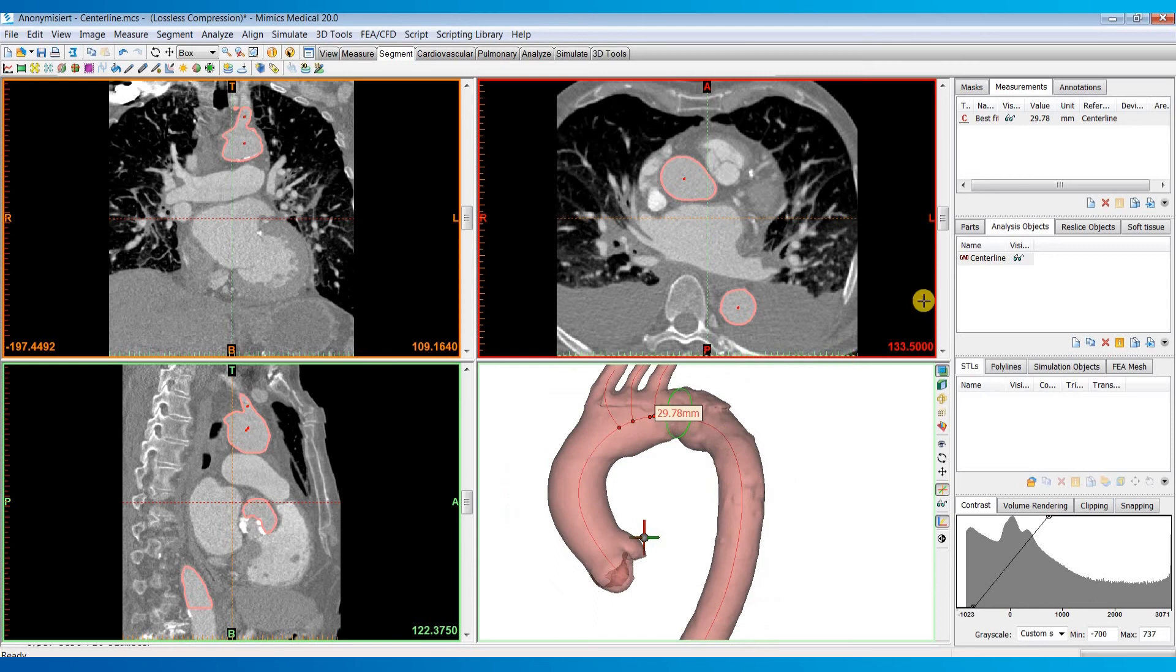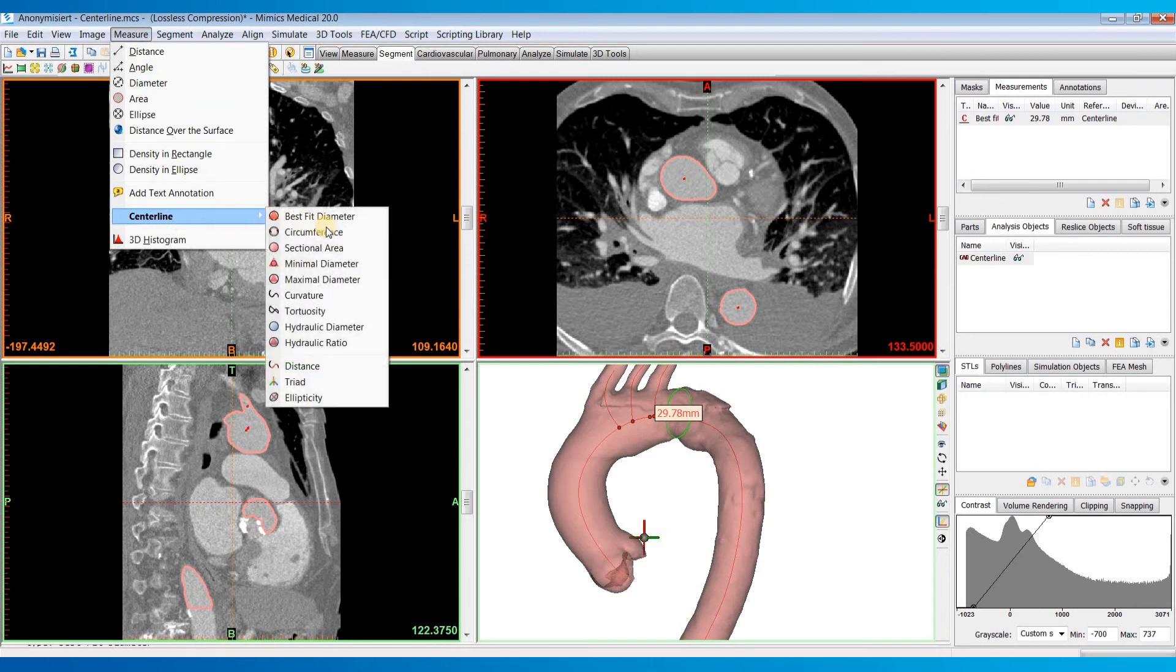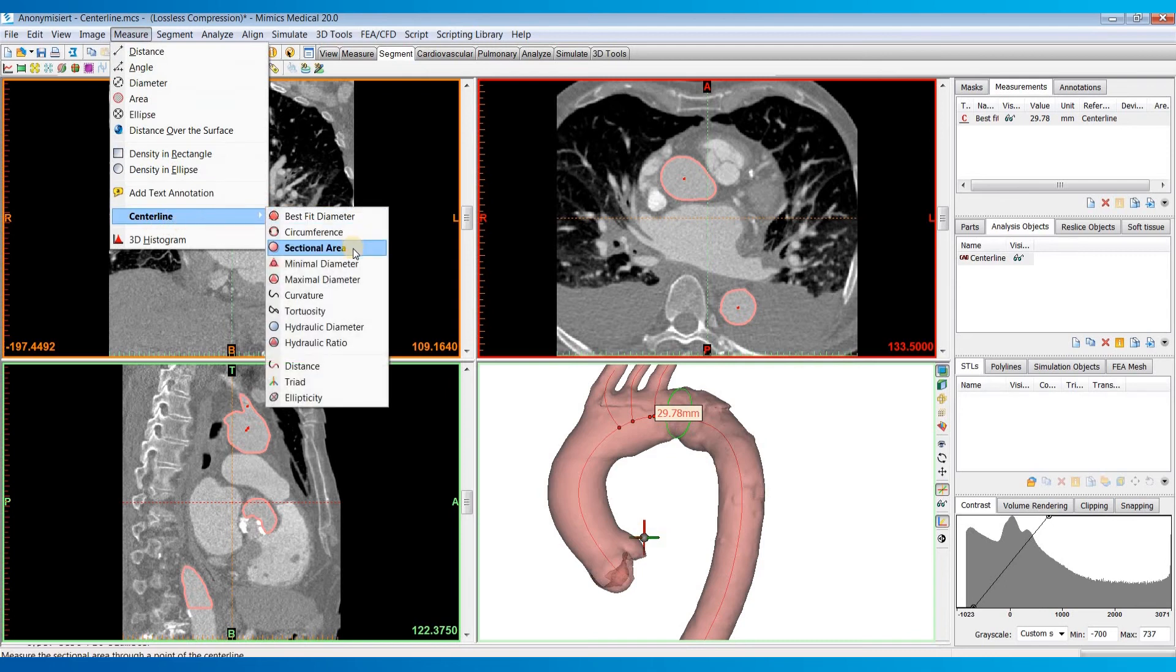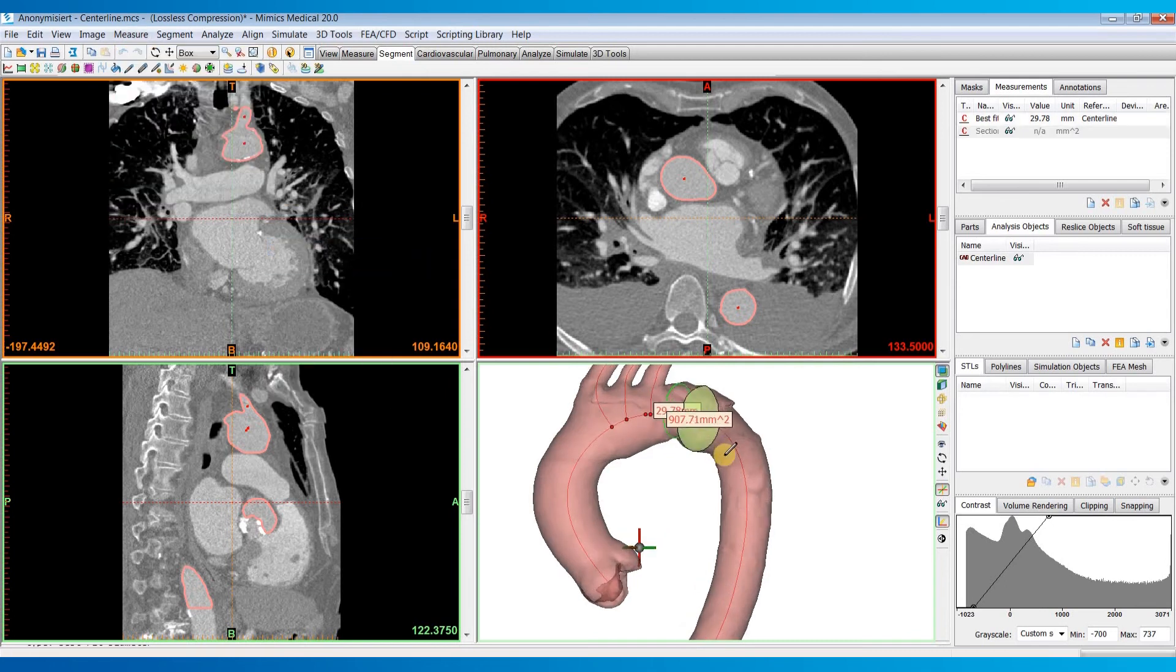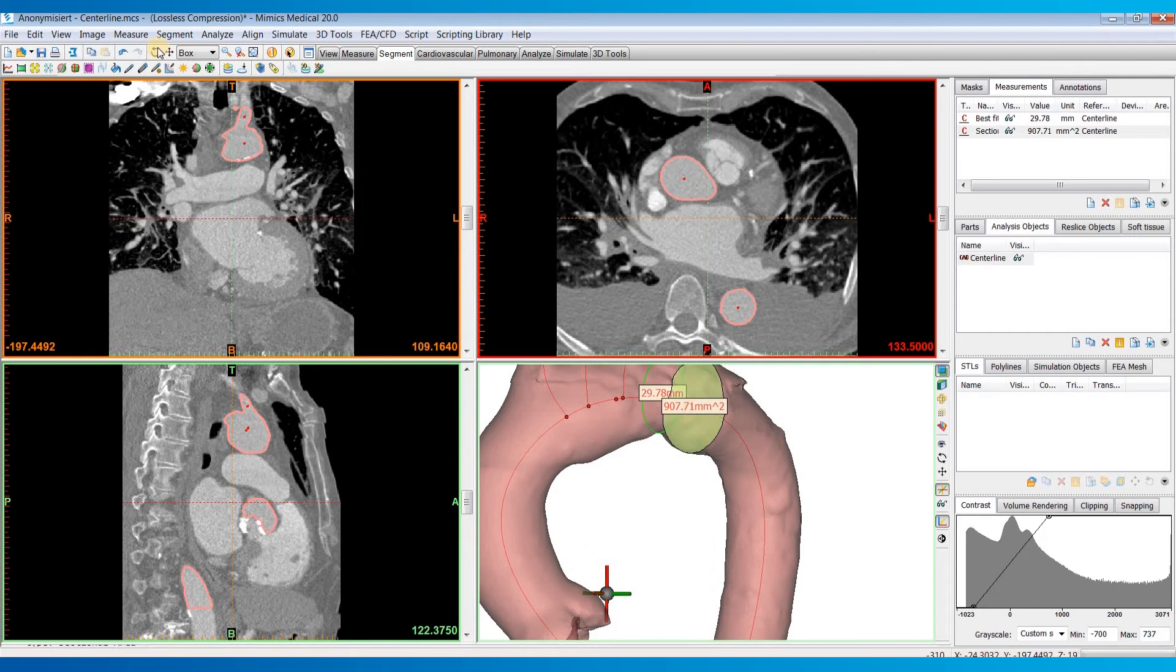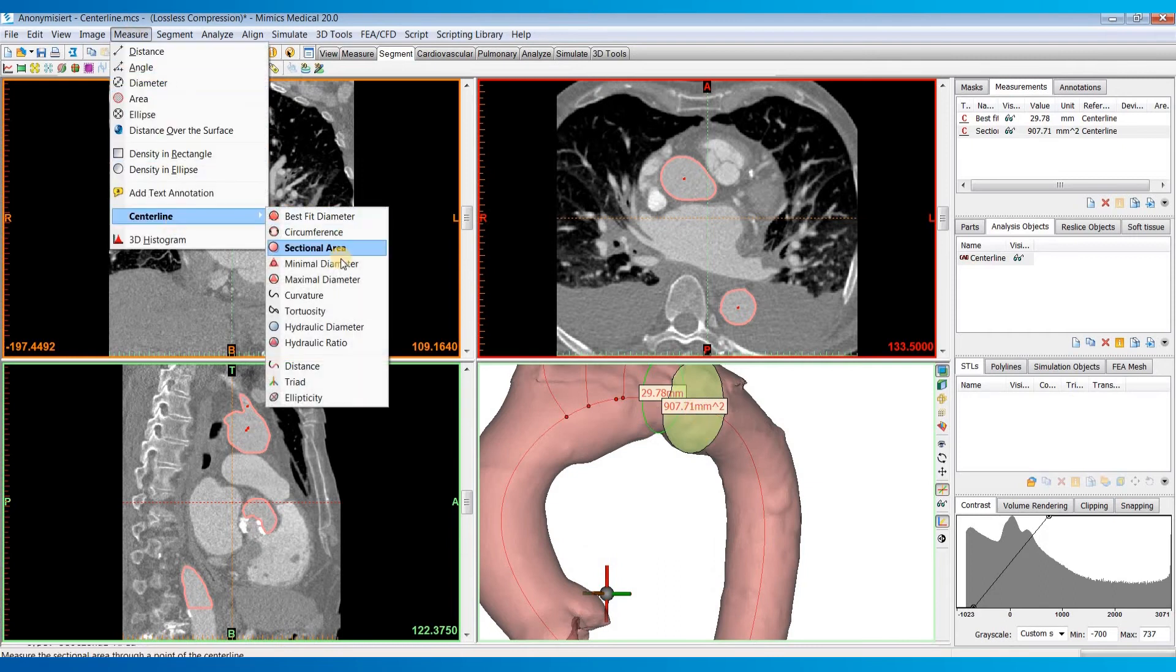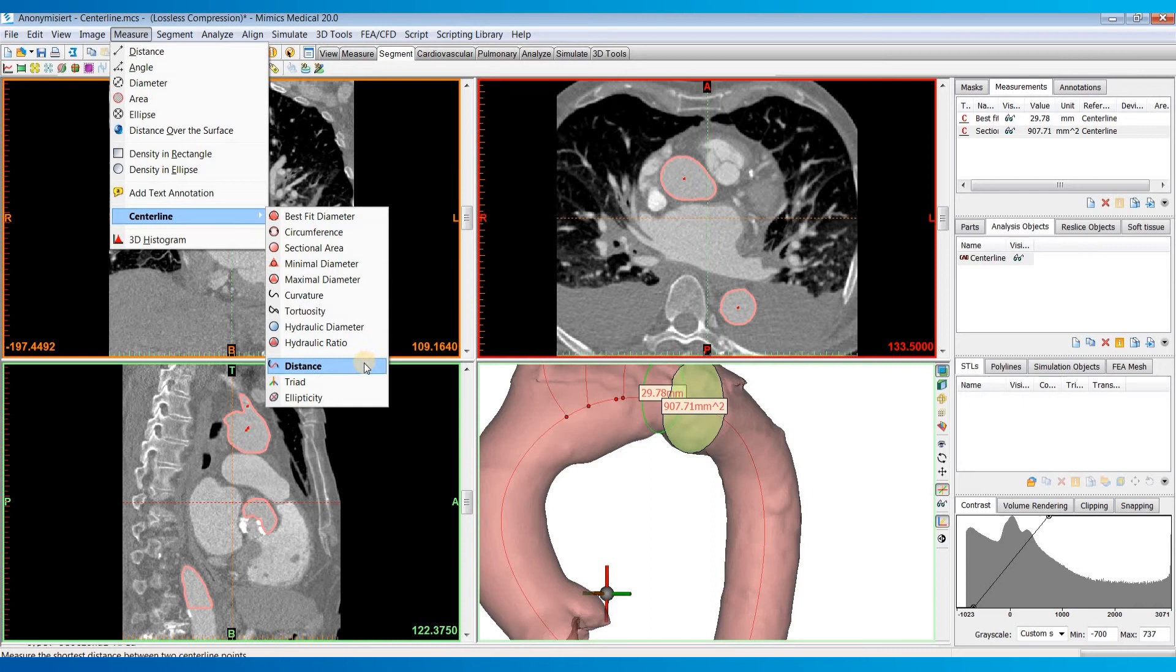And it will then appear in your measurements tab up here. So we can also do other things like the cross-sectional area.